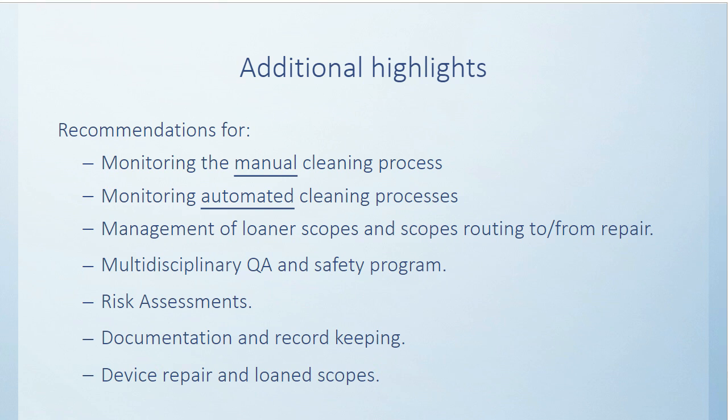We have more information on loaner scopes and what to do with those coming in and out for repair and making sure we're monitoring those. Very helpful to take borescope pictures or photos for those that you see your repairs have been done or what's going out. We do ask that you create a multidisciplinary team that looks at quality assurance and safety and implementing that program in your facility. Information in there on risk assessments and when you would want to do that. Continue the information on proper documentation and record keeping, and of course what to do when you're sending out repaired and loaned devices.